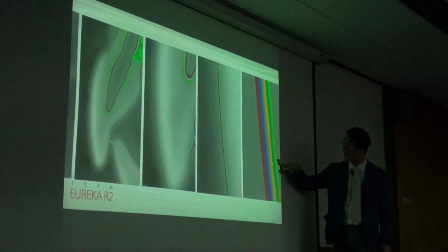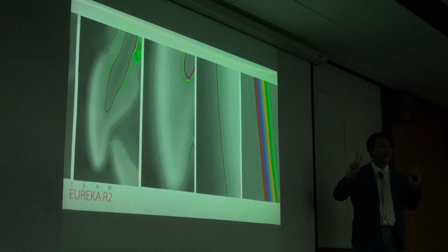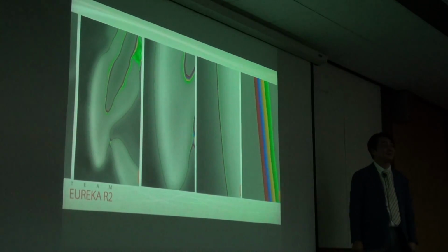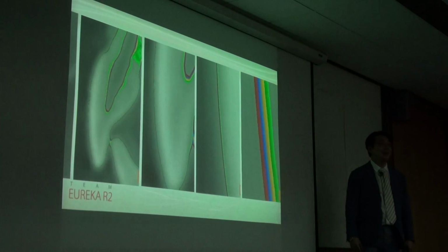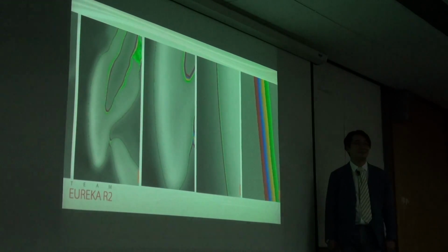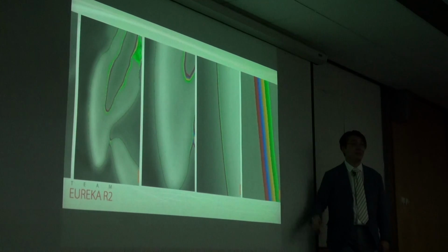It means it has a 12-layer color. Which color is the real boundary of the tooth? Do you know? I don't know. Nobody knows. It means, basically, CBCT is a fake illusion. Nobody knows the real boundary of the tooth.